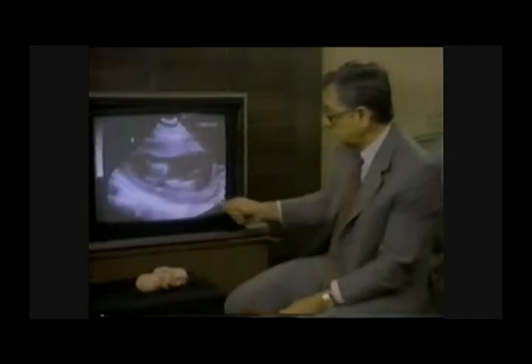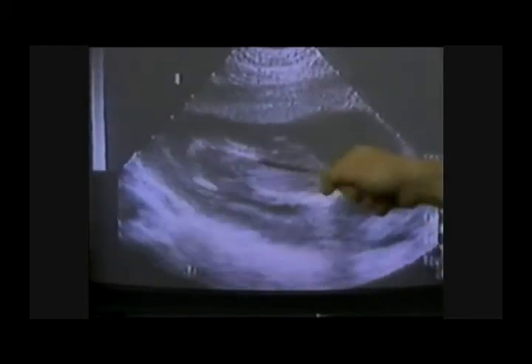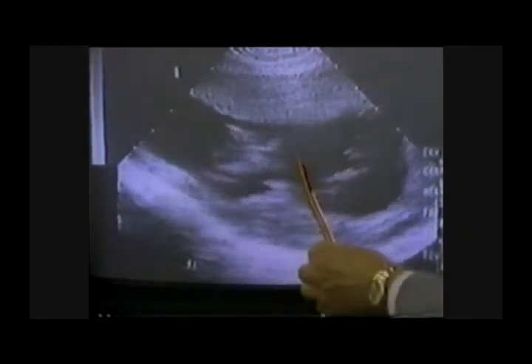The child is now moving in a much more purposeful manner. Its orientation changes from time to time. It is rearing again here. Now, the suction tip has not actually touched the child, even though the child is extremely agitated and moving in a violent manner. The child has now moved back to the profile view, and the suction tip is flashing once again across the screen. The child's mouth is now open, and we will see that again on a freeze frame in a moment. But this suction tip, which you can see moving violently back and forth on the bottom of the screen, is the lethal instrument which will ultimately tear apart and destroy the child.